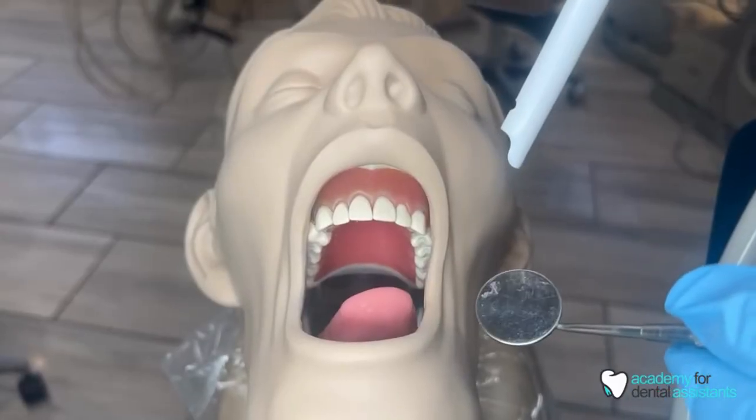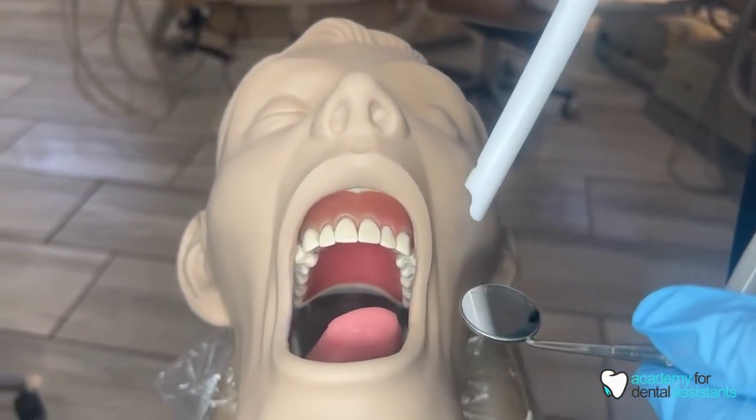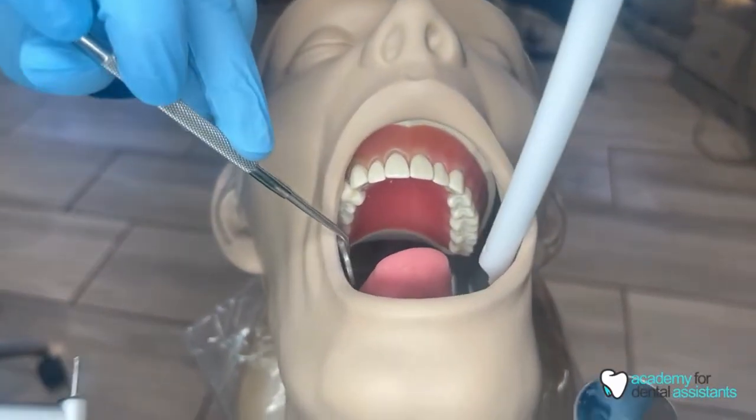As the dental assistant, you're always going to want to make sure that you have your HVE inside of the patient's mouth before the doctor would even place their handpiece inside of the patient's mouth.